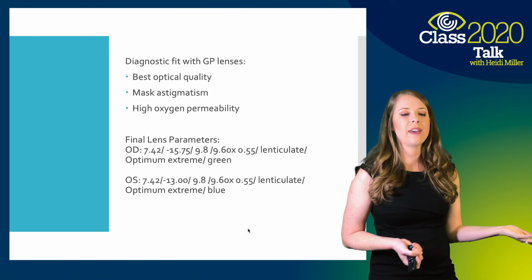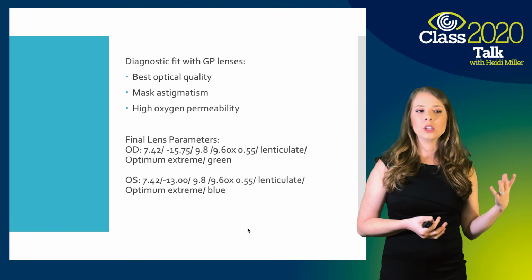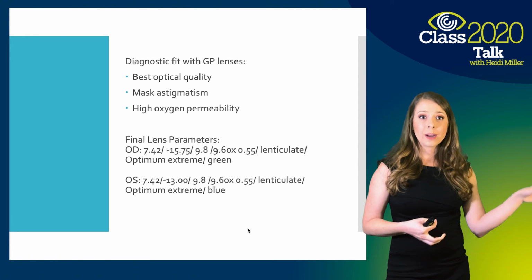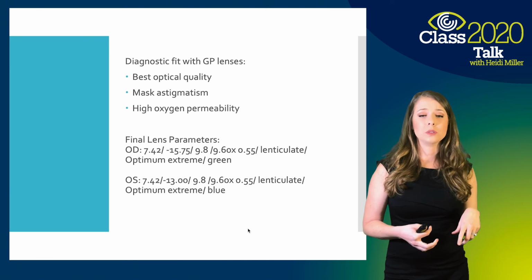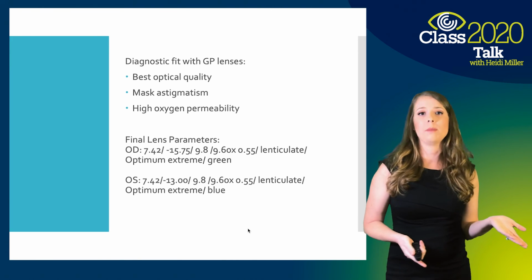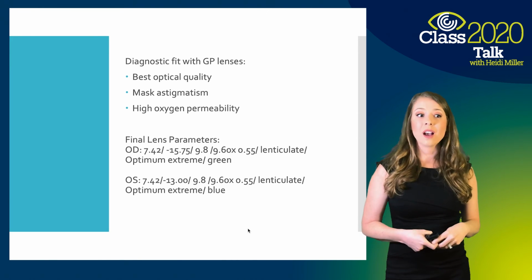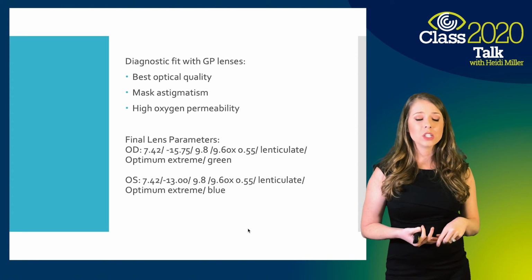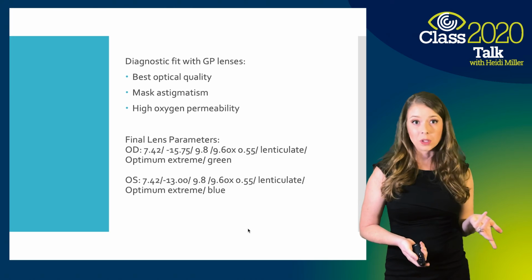So this just shows that with glasses, she was demonstrating a little bit of amblyopia in that right eye. But after wearing contacts for about 6 months to a year, she's actually equal vision in both eyes, 20/20. So those contacts made a huge difference for her in terms of optical quality, magnification differences, and now she's seeing equal acuity in both eyes.